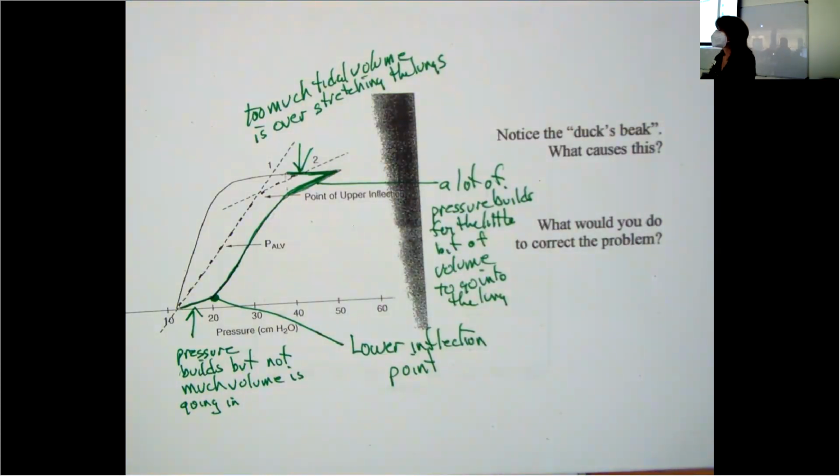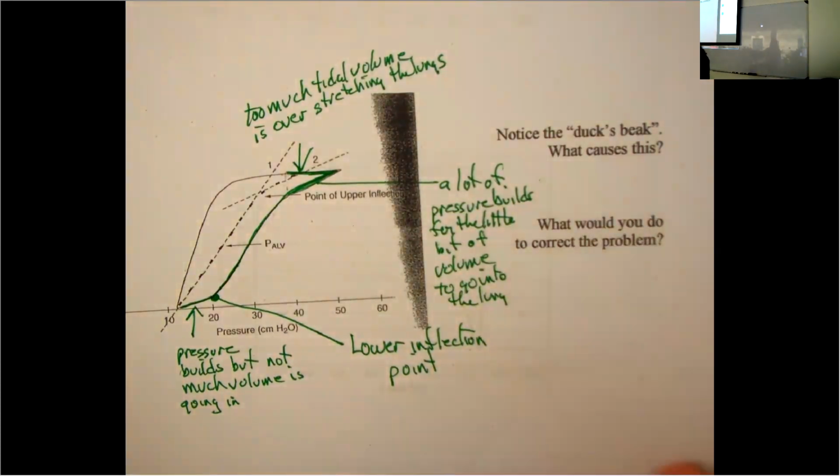So the lower inflection point. Yes. But I think it's asking about the duck's beak. And yeah, when we talk about PEEP, we talk about the lower inflection point and how to set PEEP according to the lower inflection point. I don't want to tell you that right now.